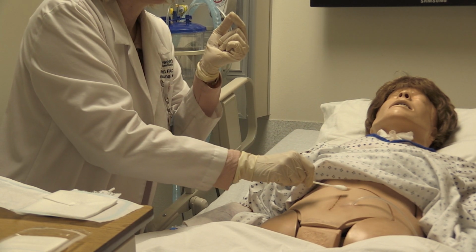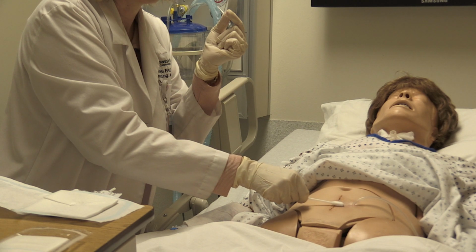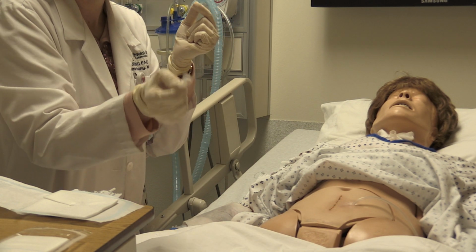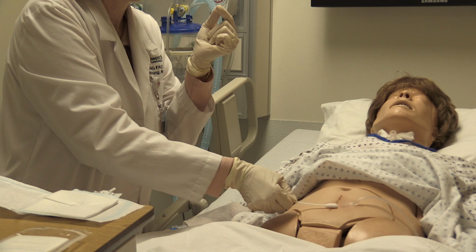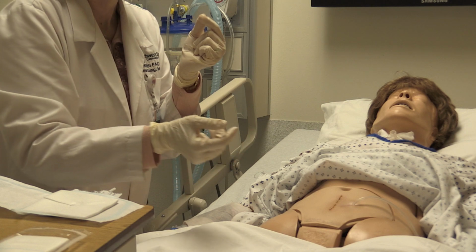I'm going to go again to the proximal side of the incision. I'm just going to kind of roll as I swipe one time down. I'm going to discard that one, get another one out. I'm going to go right down the center of the incision. Again, I just roll as I go. Discard that.